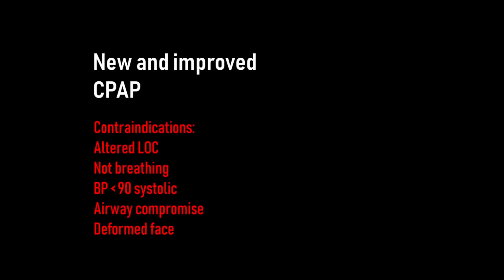The contraindications from the protocols are an altered mental status or an inability to follow commands, and a patient that is apneic. Respiratory arrest is not appropriate for CPAP. Those patients need immediate bag mask ventilation. If you were to place the CPAP device and find that the patient went into respiratory arrest, immediately remove the CPAP device and proceed with bag mask ventilation.